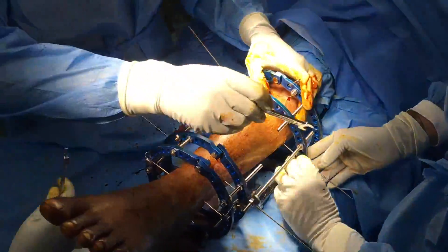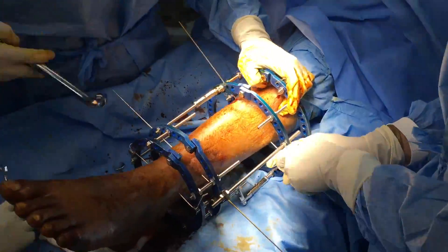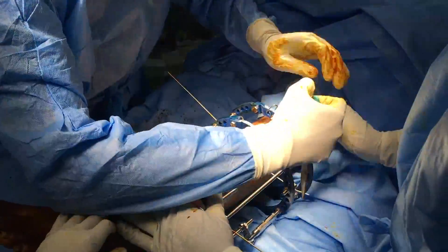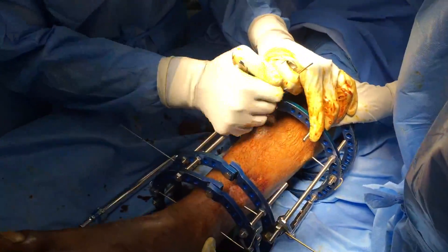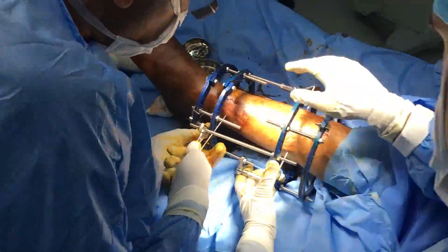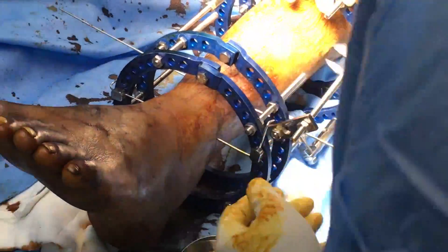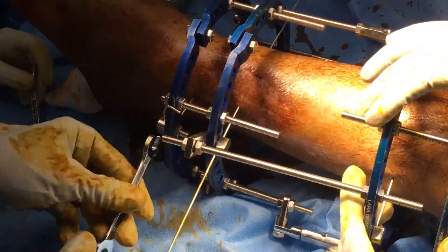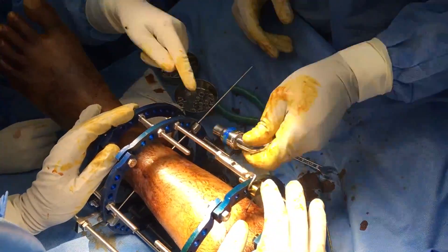We will need to tension the wire to about 100 or 120 kilograms, and at this stage if we tap the wire we shall get a resonating noise. The Russian method of tensioning involves centre slot bolts which are twisted by 90 degrees or more, winding the K-wire around the nut, resulting in stretching of the K-wire and the tapping noise changing from tinny to highly resonant.